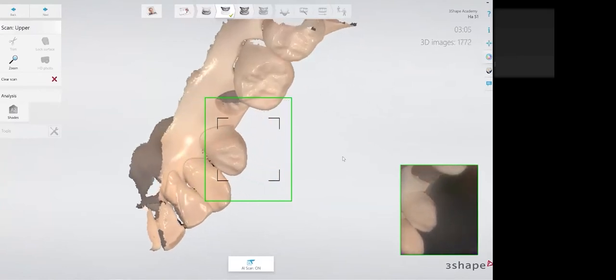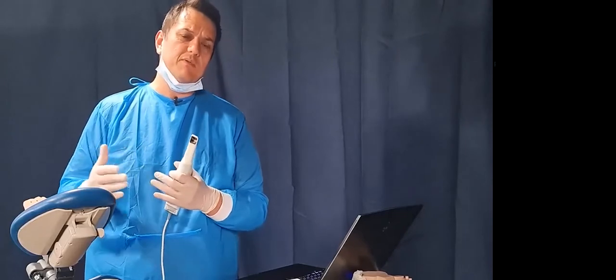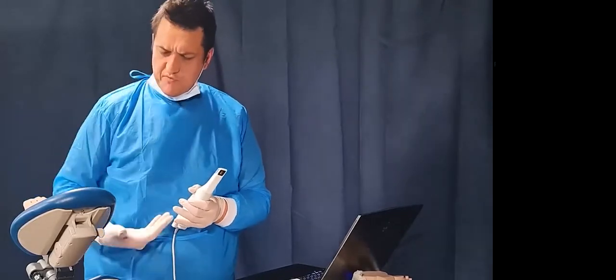Like so. So now we've got all the undercuts, and it's quite tricky. You saw that. I've got all the hand positions moving and happening, but we do get there eventually. Now, sometimes there are some undercuts that are so far buried under, and you find that on crowns or implants, potentially an abutment tooth is an implant, and it just sinks so far under.